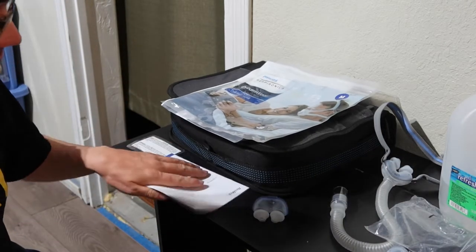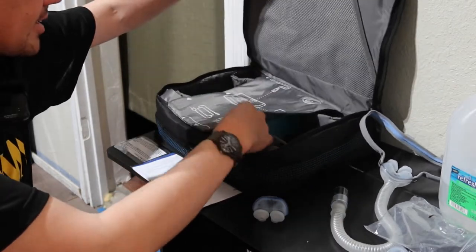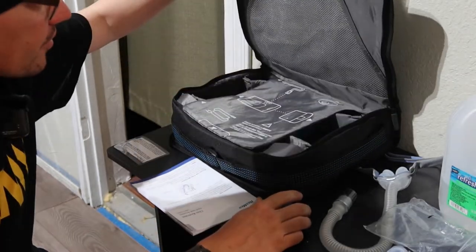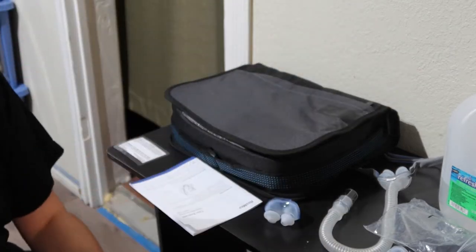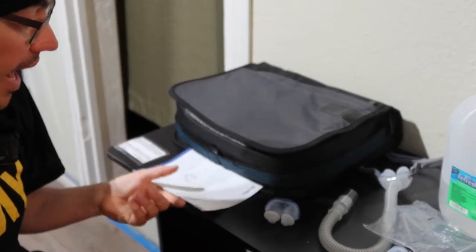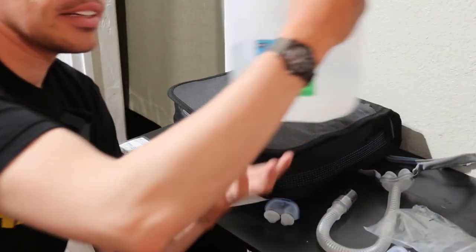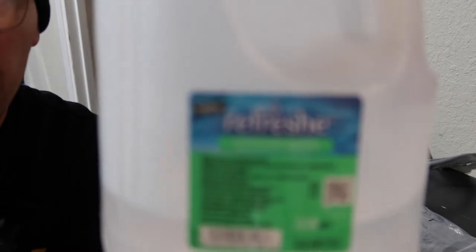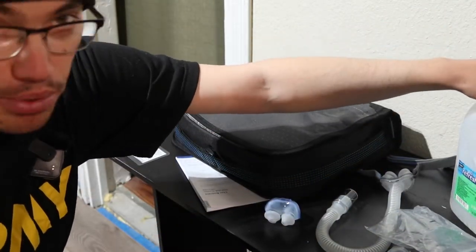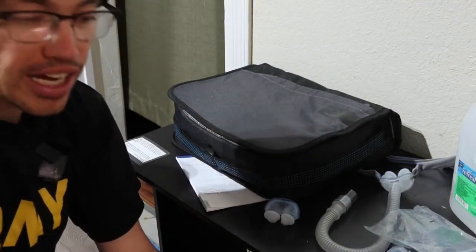First, you get a fancy case with all the cords and accessories inside. Then you get a bunch of paperwork. One thing you have to be deliberate about is you need distilled water — not tap water, not boiled water — but distilled water because it's without impurities such as iron, vitamins, and calcium deposits.